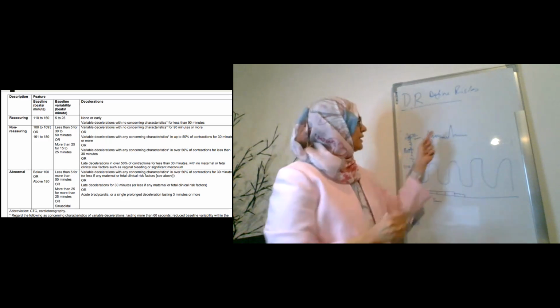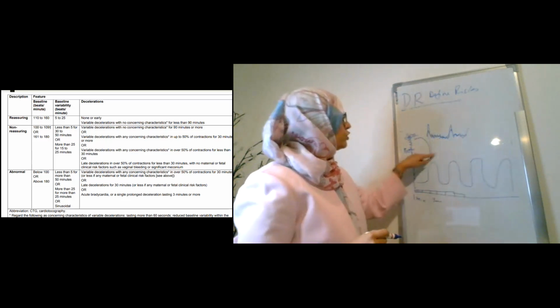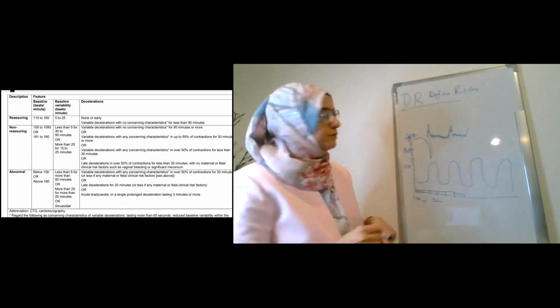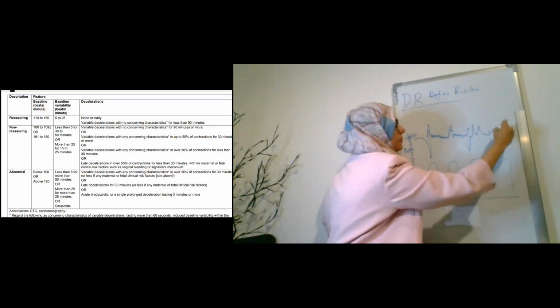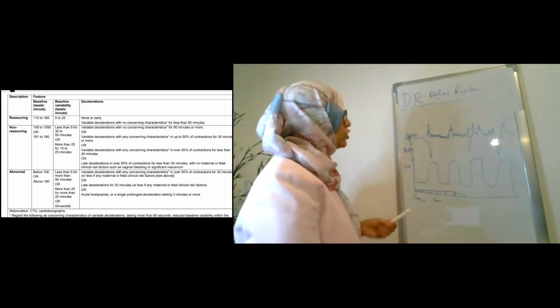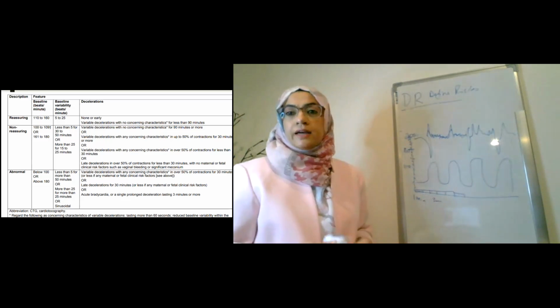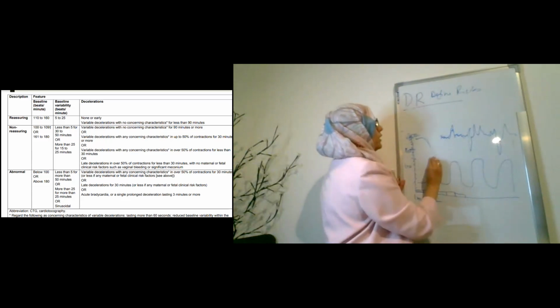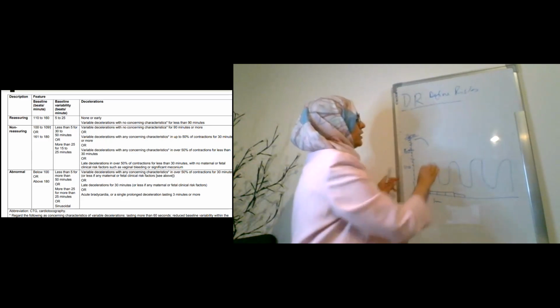It went down quickly, it came back, and then it really said, okay, I'm good, and it carries on, okay? So you're not really concerned about these kind of decelerations, even if they're quick to come, and then they happen, and then they go away, right? So they don't have any concerning characteristics. Which is the deceleration that now you are going to worry about?